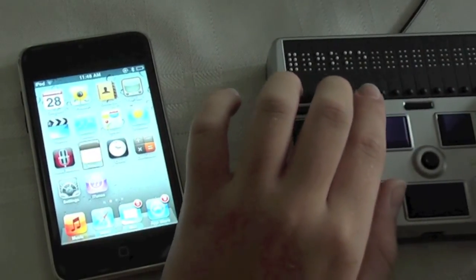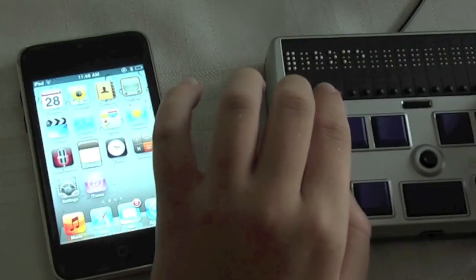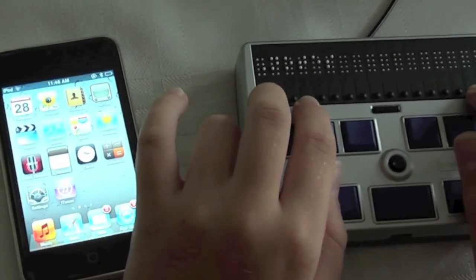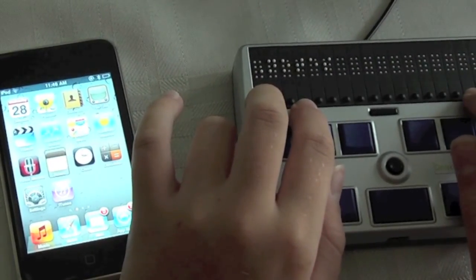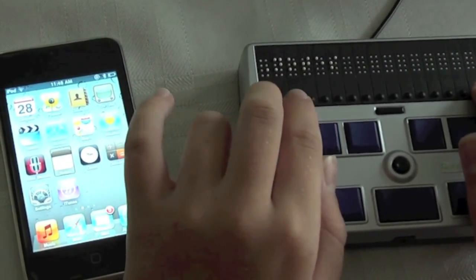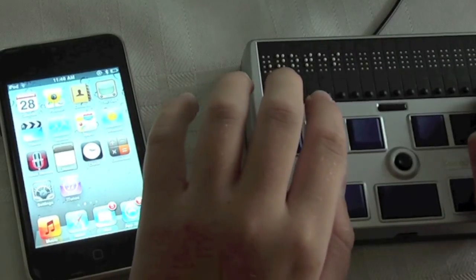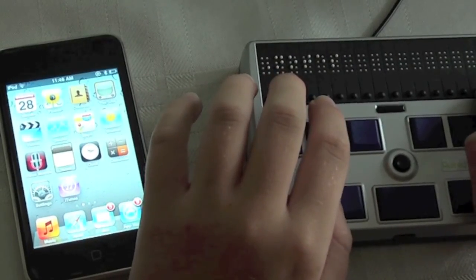I'll now return to the home screen with H chord. That is all that I want to show you. I'll be back in a future video talking more about connecting the Refresher Braille 18 with other devices.